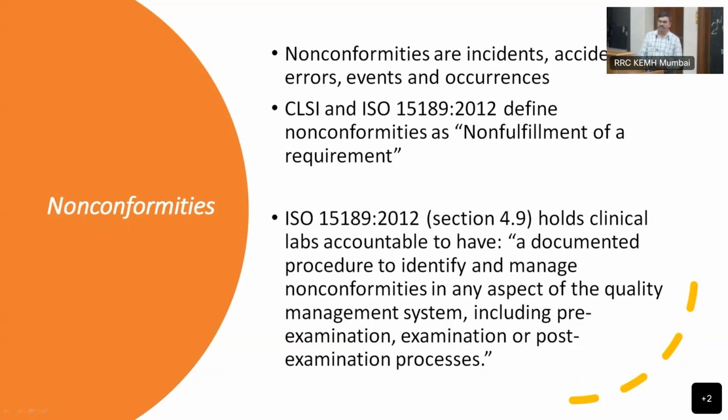In that quality requirement, root cause analysis, corrective action, preventive action, and checking the effectiveness of corrective action are put into one single clause. I think it is 8.7. As far as I remember, I haven't studied it thoroughly.